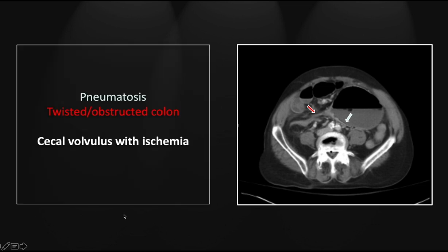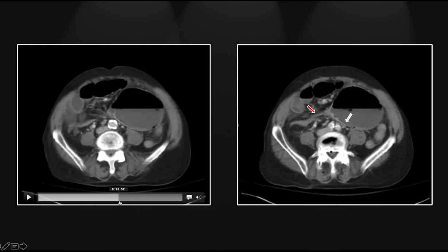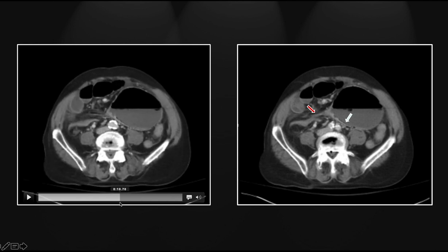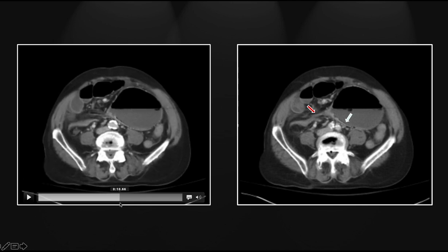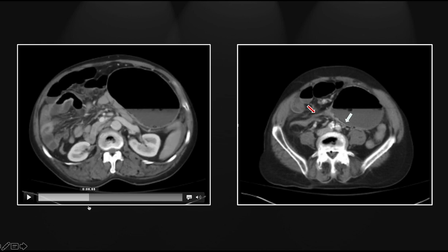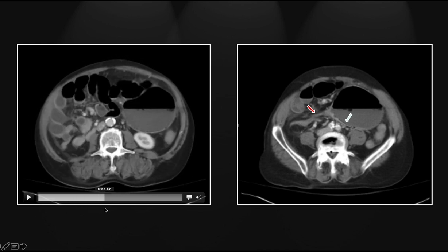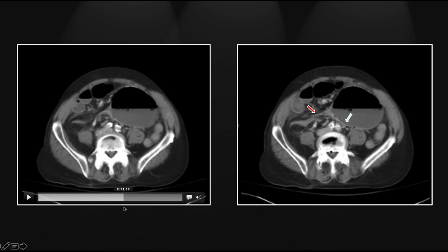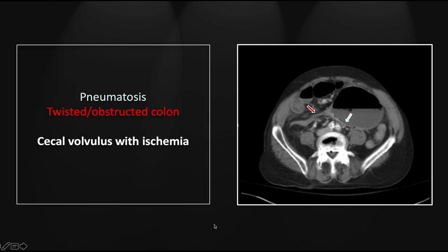Here again you see that segment of narrowing and elongation in the right lower quadrant, which probably represents the mid-ascending colon. Note also marked dilation of the small bowel, especially on the right aspect of the abdomen. So that is a case of a cecal volvulus with associated ischemia.